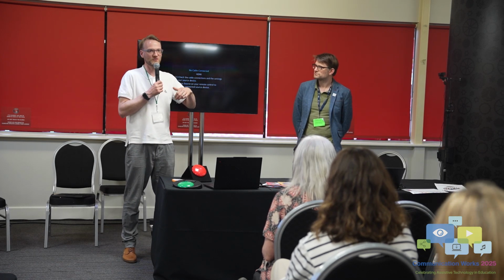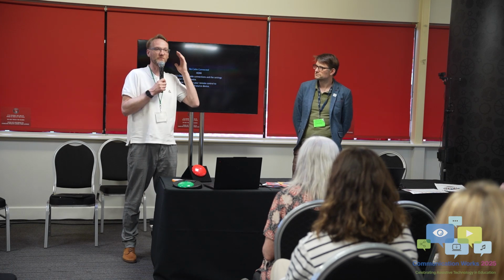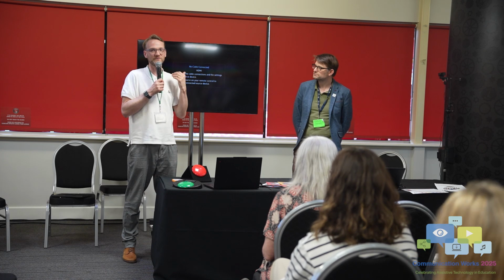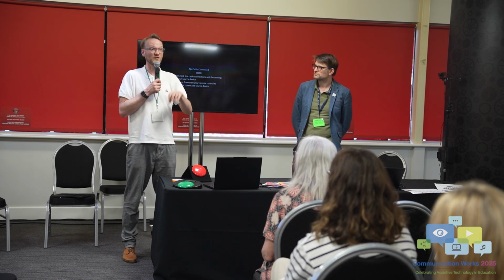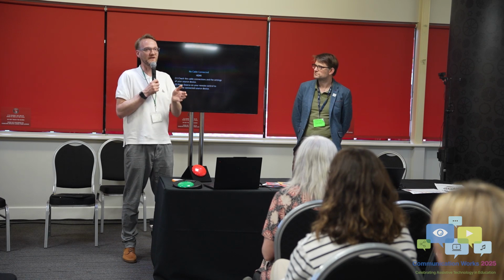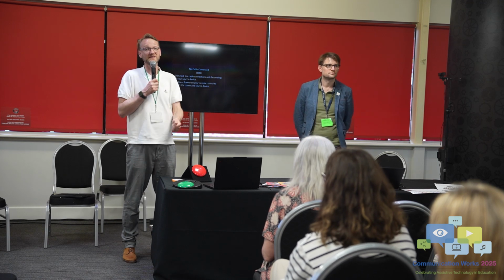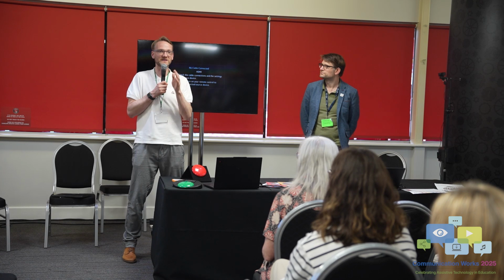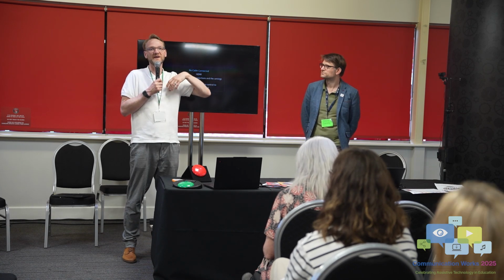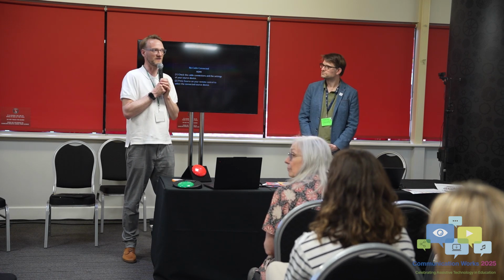What we've found is that there are children who grow up with only a limited, maybe one, way of accessing the switch, and then they lose that function and can't carry on communicating or using their equipment. So it's good to explore, but there is a logic behind motor patterns developing if there is a consistent place. In this journey, when we started we've got a primary and secondary switch site, but then we continue to explore other ones. So again, it's getting that balance. I don't think it's a law.